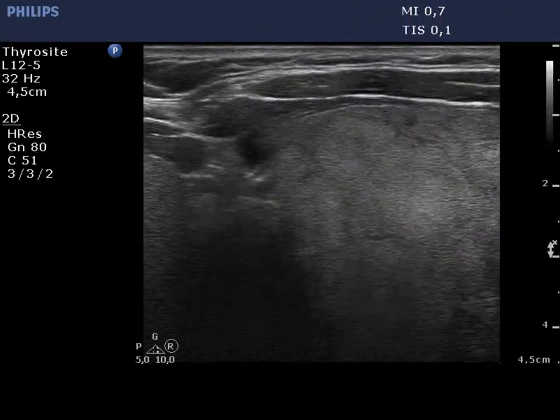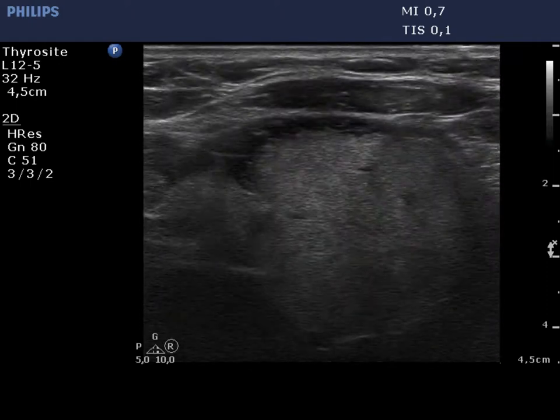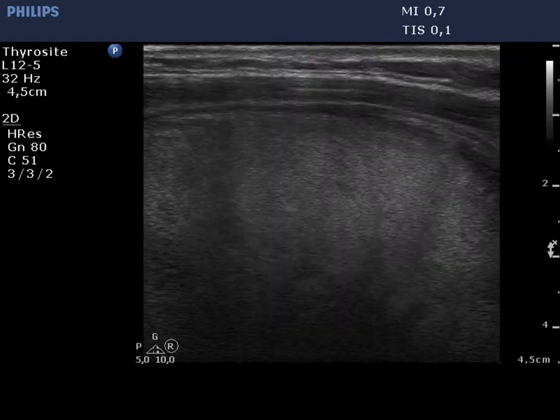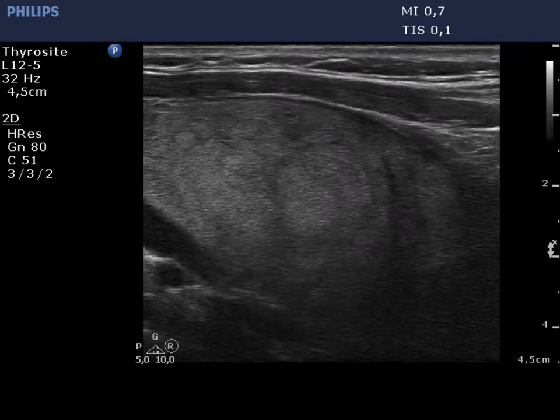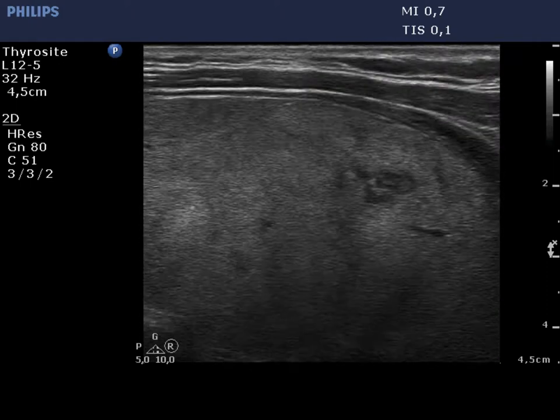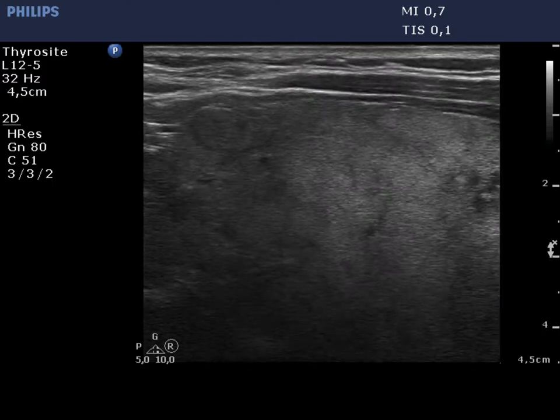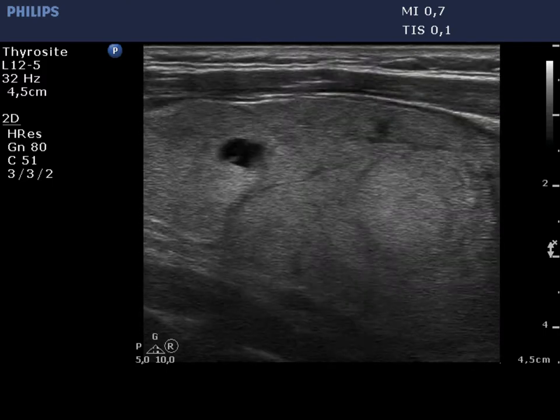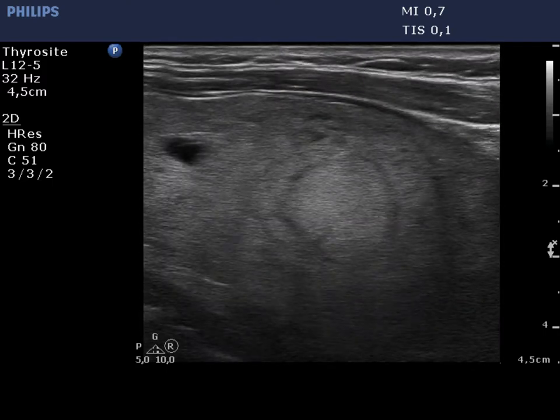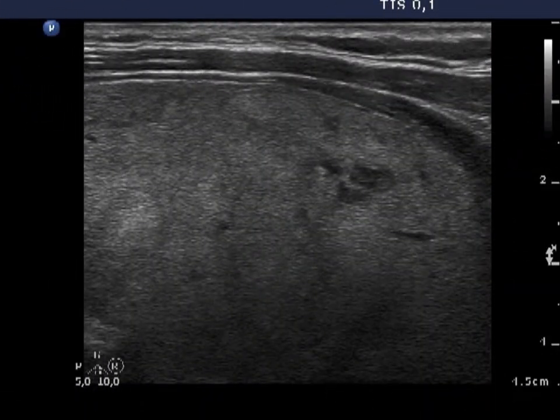The left lobe is similar to the contralateral one. There is a small inhomogeneous hypoechoic area at the border of the middle and lower part. This lesion is presented in the images.